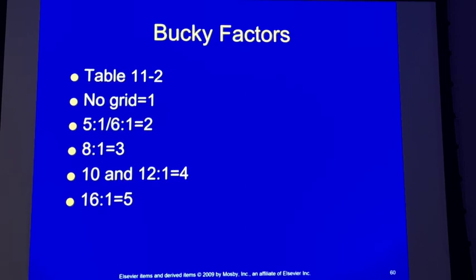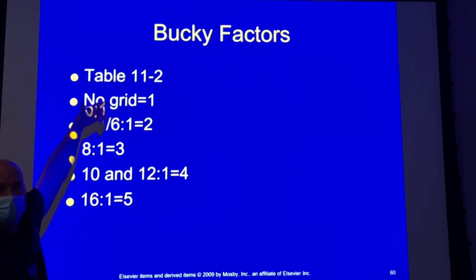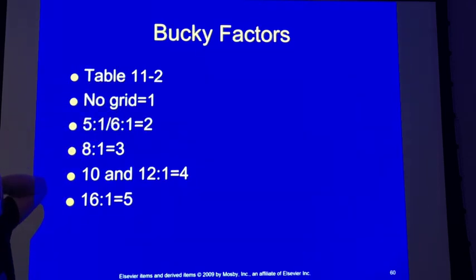Same thing. It's going to be too light or your index number is going to show that you underexposed. So if you go from a technique using an 8:1 to no grid at all, then what's it going to show? Overexposure if you didn't adjust your technique, okay?